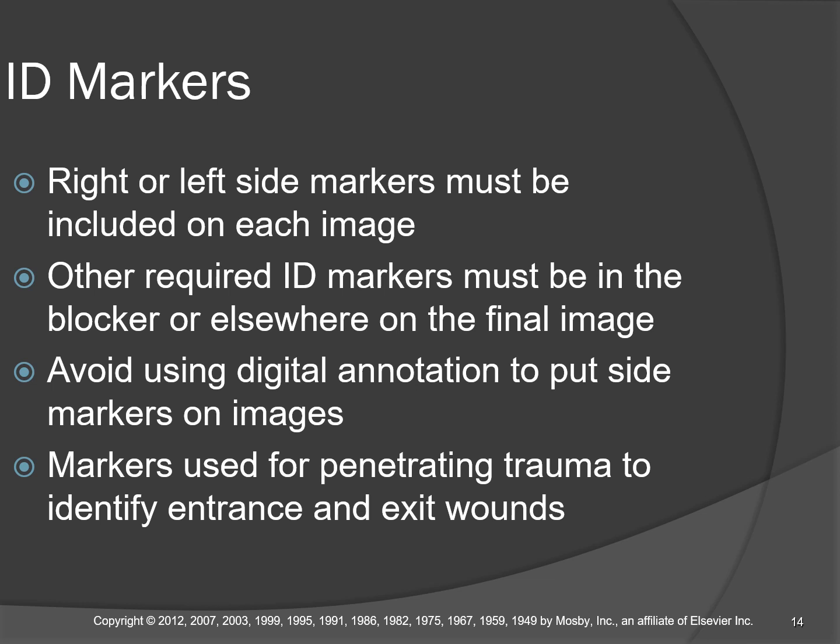You can do that with a digital annotation, but send him or her an unmarked copy first, make a duplicate of that, and then mark up the duplicate. That way the radiologist can pivot back to the unmarked one, because you might inadvertently superimpose something with your digital annotation.